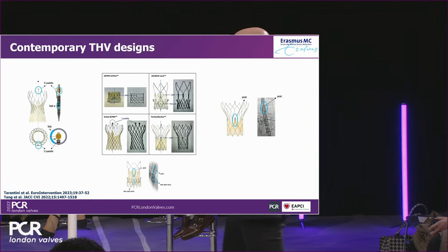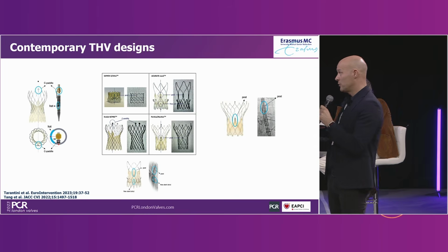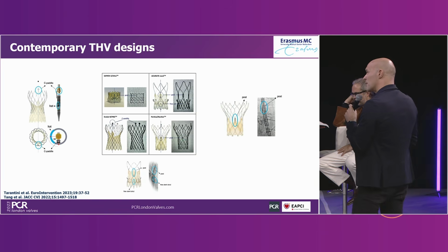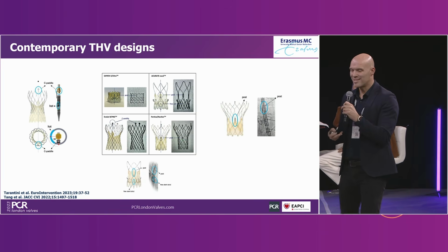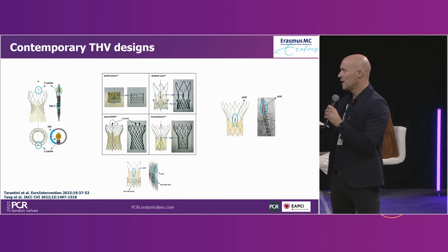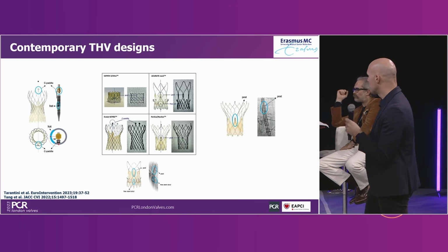So there are several references that you can use, and they're different for an Evolut valve as compared to an Accurate valve as compared to Navitor. For the time being, I'm not so concerned with balloon expandable valves, and if you ask me, the simplest way of commissural alignment can be achieved with the Accurate valve, but I think that Fadi is going to dive into that.